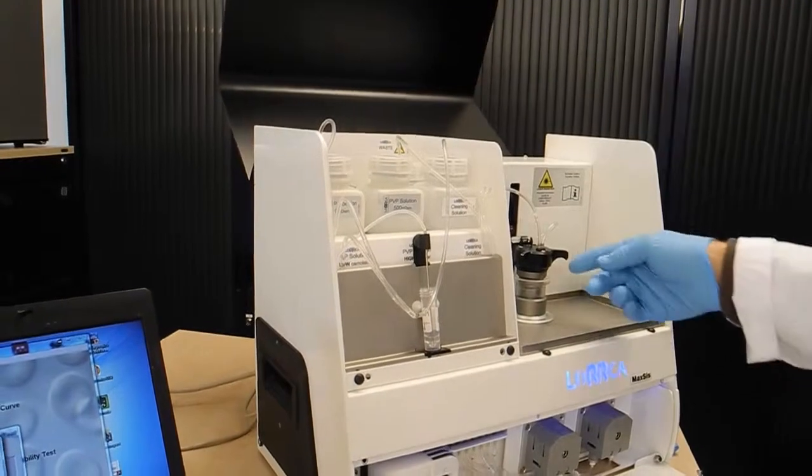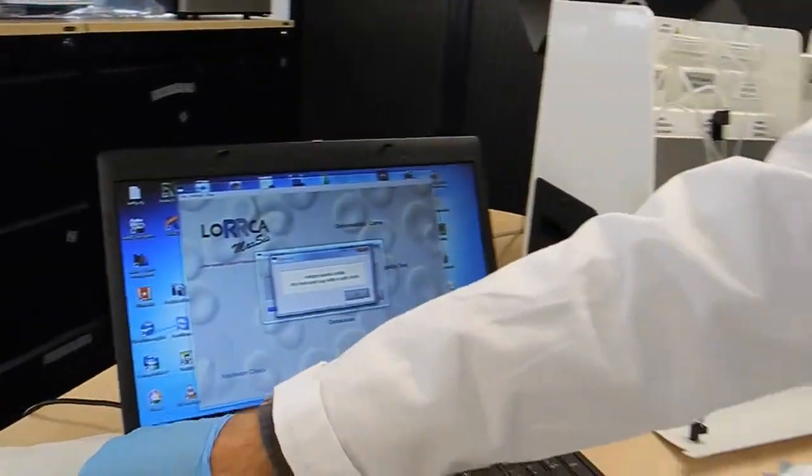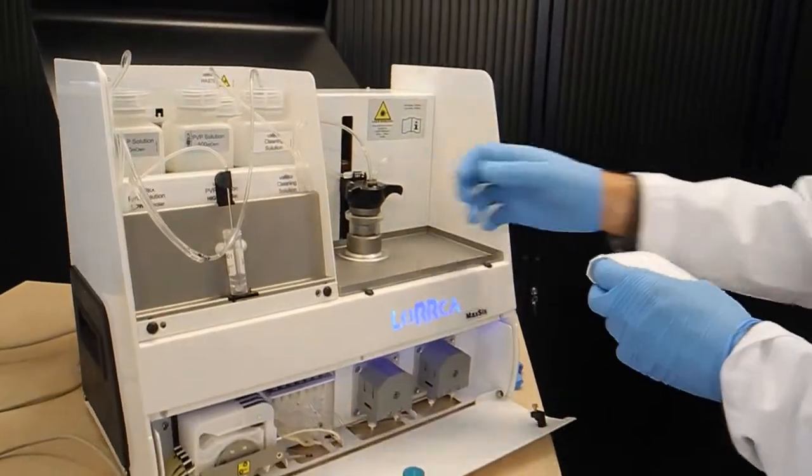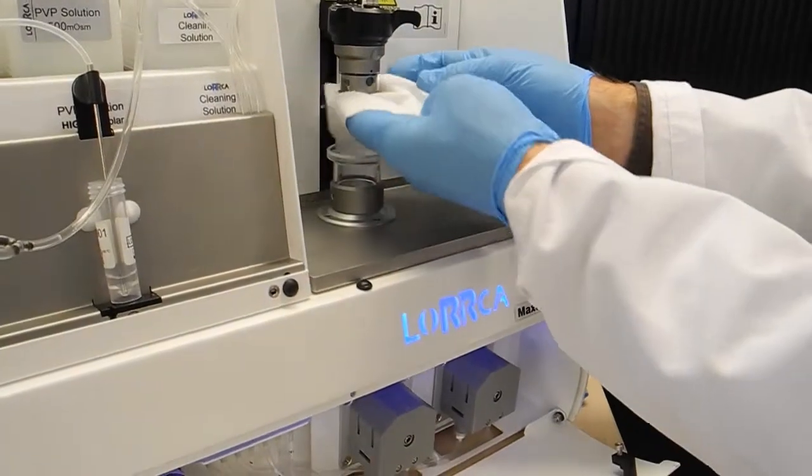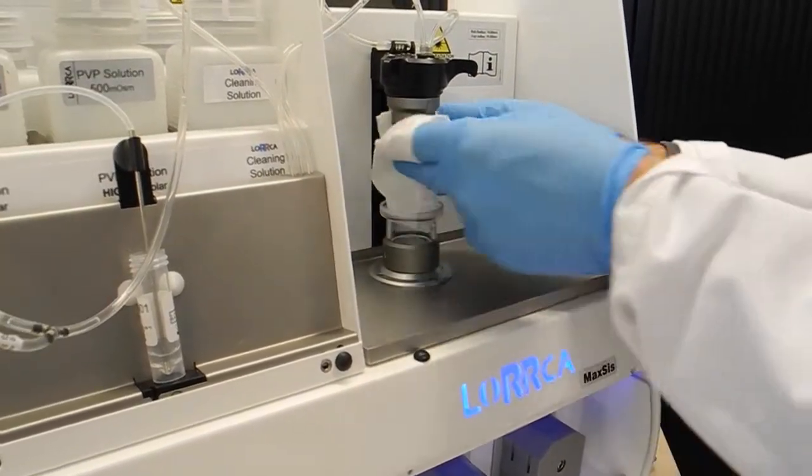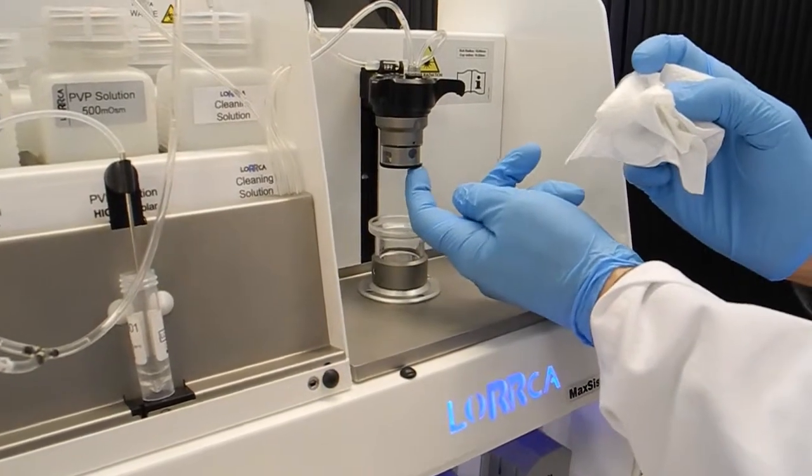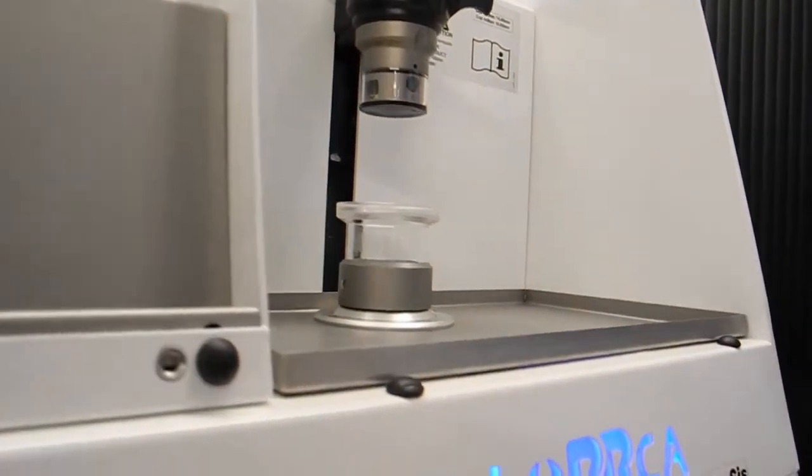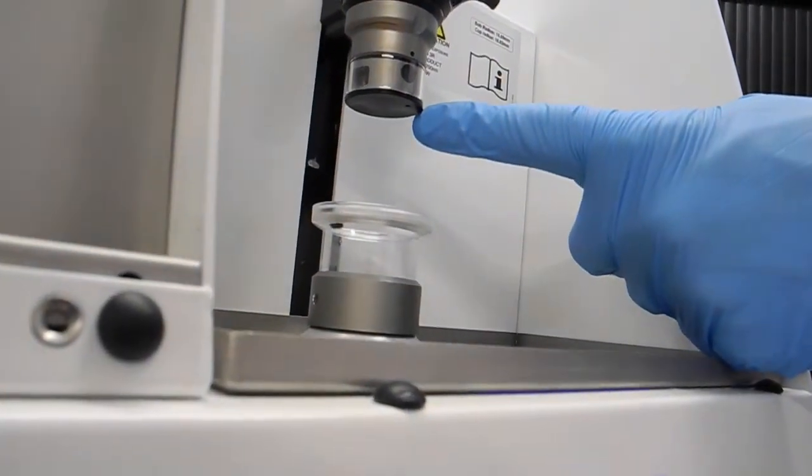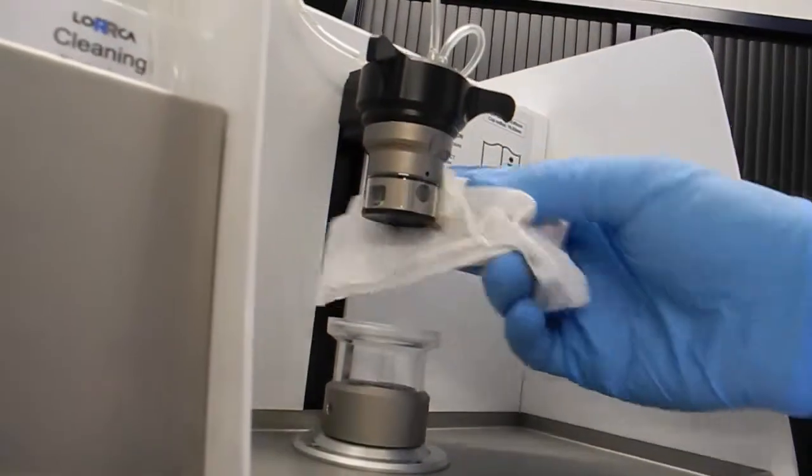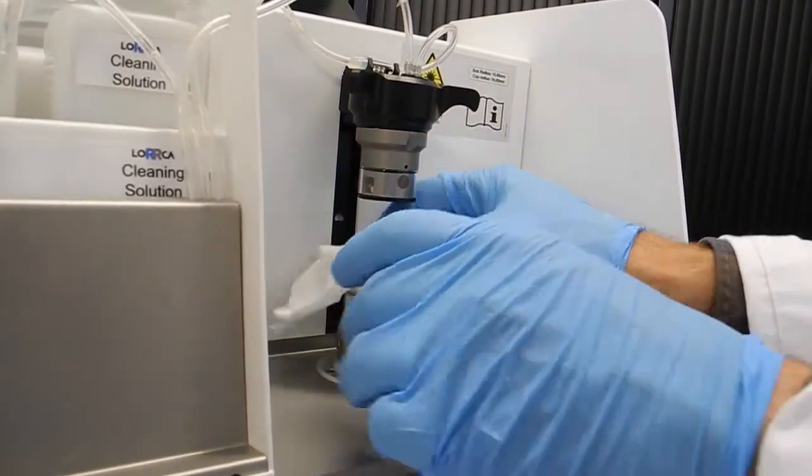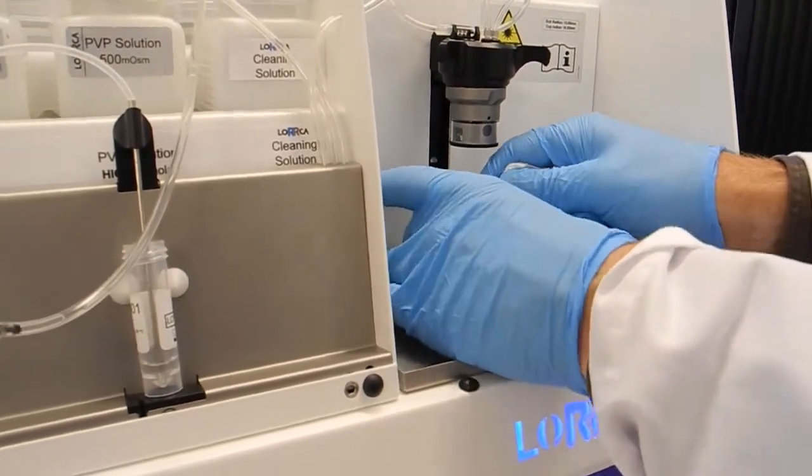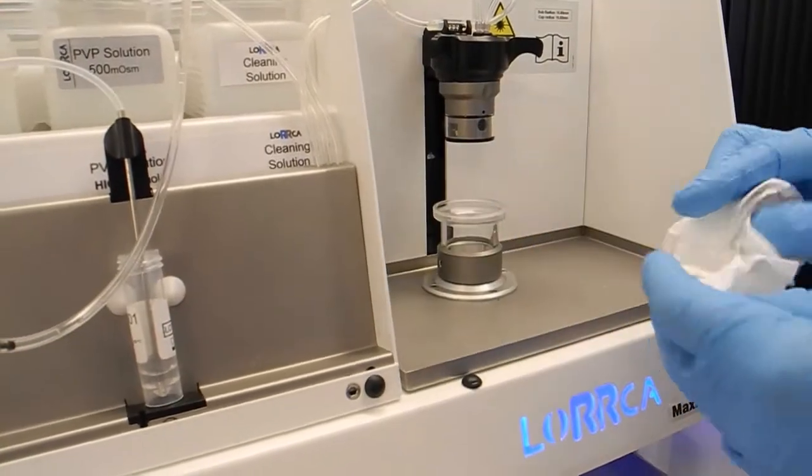Dry the bulb with a dry cloth. Dry especially underneath because here you can find the entry and exit of the fluid, which shouldn't become blocked by PVP or anything else. Dry the bulb and we're done.